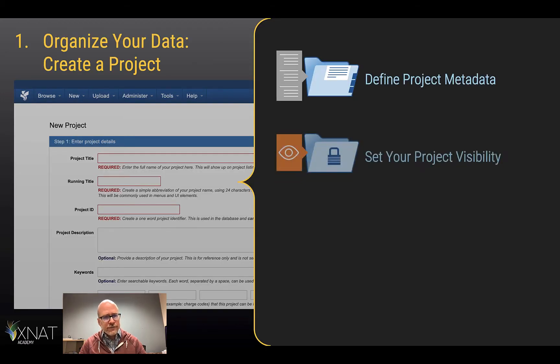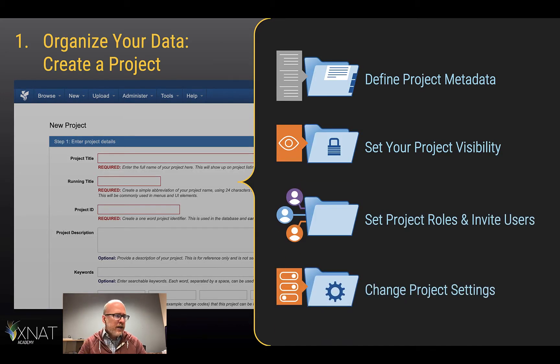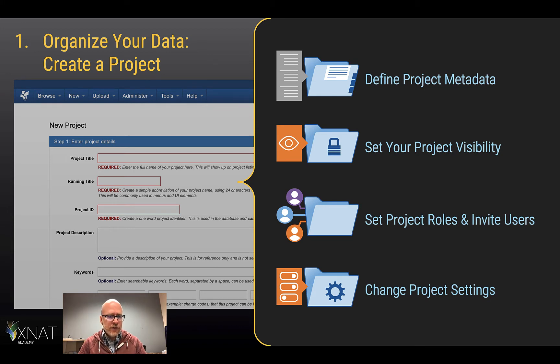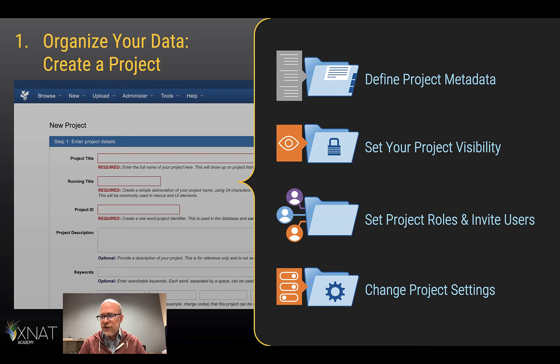First, you can organize your data by creating projects and then defining what describes that project, who can see it, and who explicitly has access to it and in what roles. You can invite new users as well here. You can even connect to external authentication systems such as LDAP and OpenID. And you can do a lot of customization from one project to the next to specify how you want to manage your data.